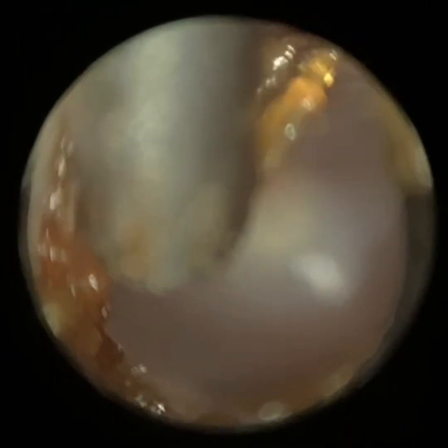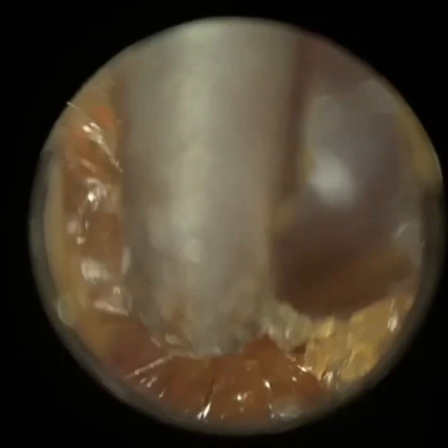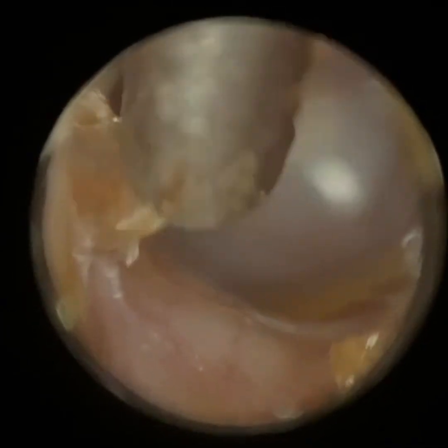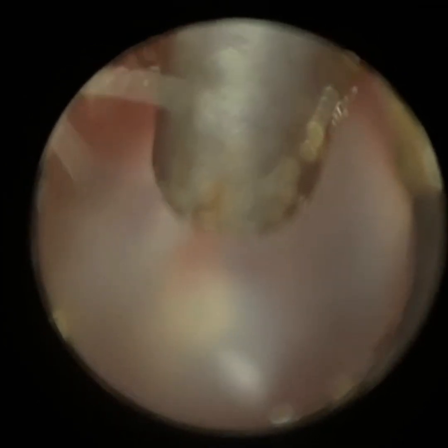Previously he didn't feel confident because he couldn't really differentiate between the wax and skin in the canal due to the lack of magnification. The image quality may not be as good as what Max was seeing when performing the procedure — it's just because he shared it via WhatsApp and the footage quality isn't as good when forwarded. It's just some skin that he's peeling here, and I think there's just a bit of wax at the roof of the ear canal. He's just angling the Waxscope upwards to the roof, allowing the suction to do the work.